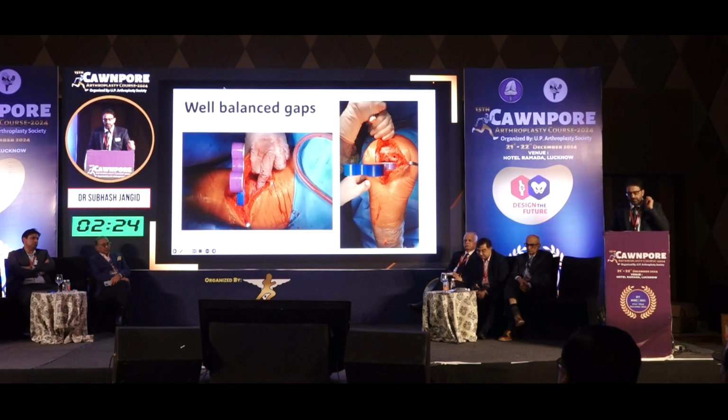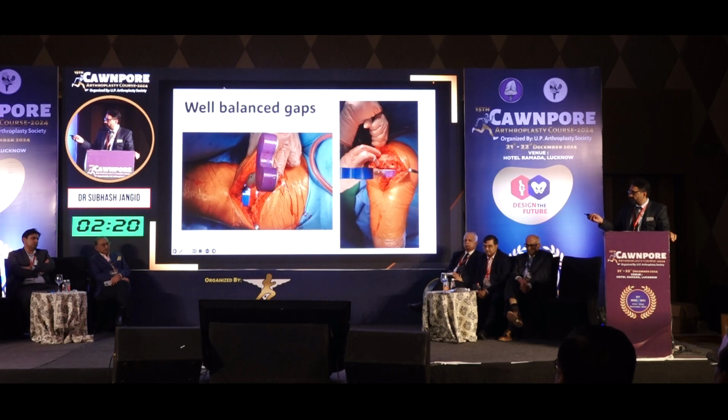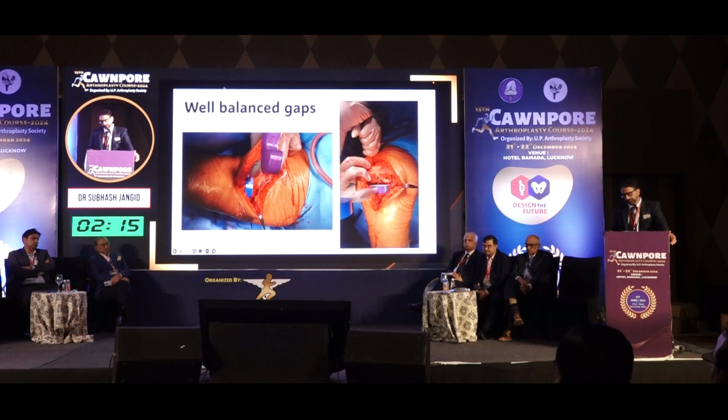A well-balanced gap is very, very important. As you've seen, a little bit of opening in flexion is fine. In extension, usually it's a rock-solid extension.